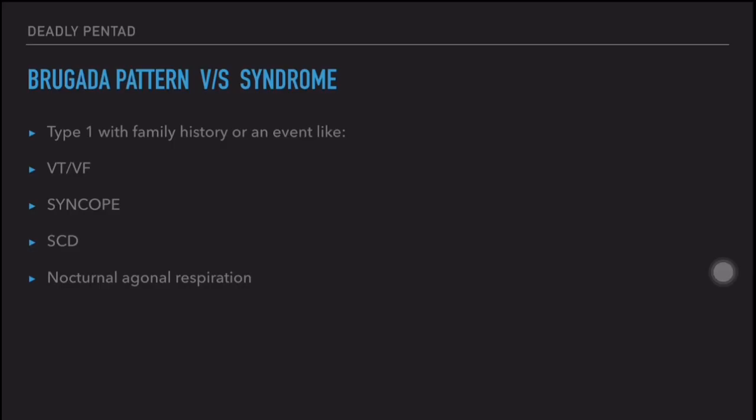What is the difference between Brugada pattern and Brugada syndrome? Brugada syndrome means the Type 1 Brugada pattern with family history, or a personal event such as ventricular tachycardia, ventricular fibrillation, syncope, sudden cardiac death, or nocturnal agonal respiration. The ECG changes alone are called Brugada pattern.